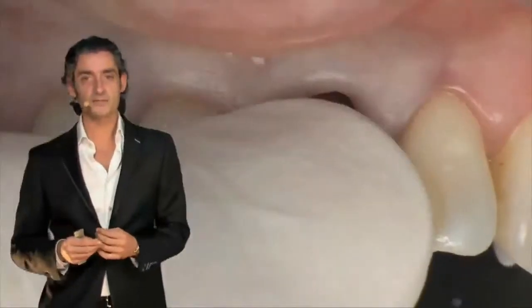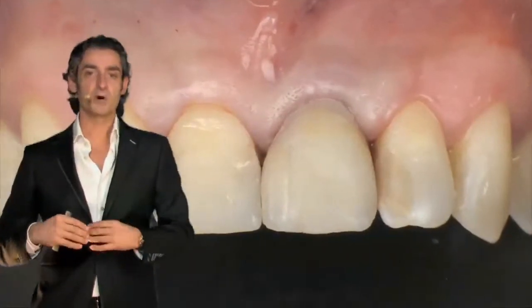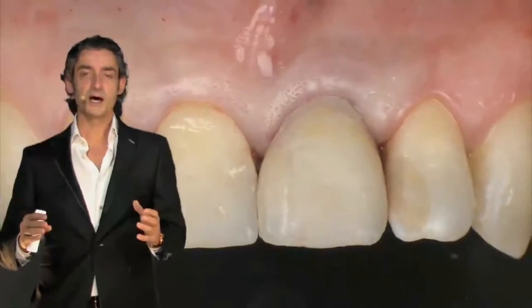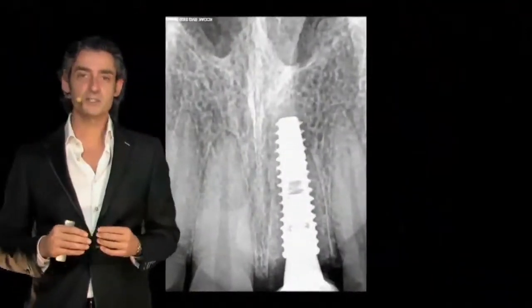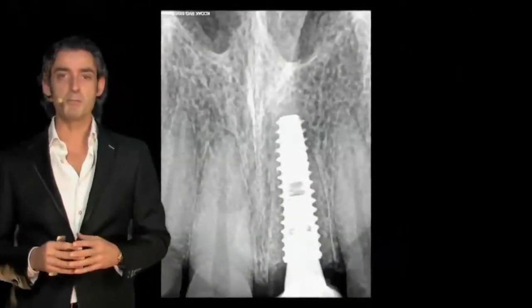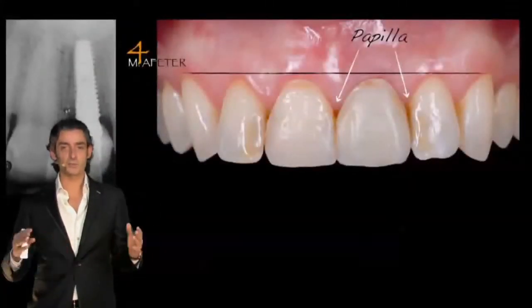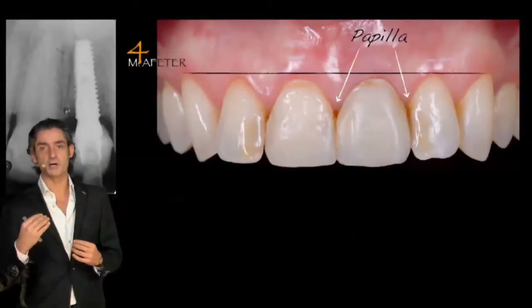And look at here, after the fixation, I'm going to take it out, and then I'm going to refine and then place it in the mouth. And look at here, this was after the surgery, no incision, anything, and this was the X-ray after the extraction. So the position was good, everything was nice, and I tried to under contour the buccal side.